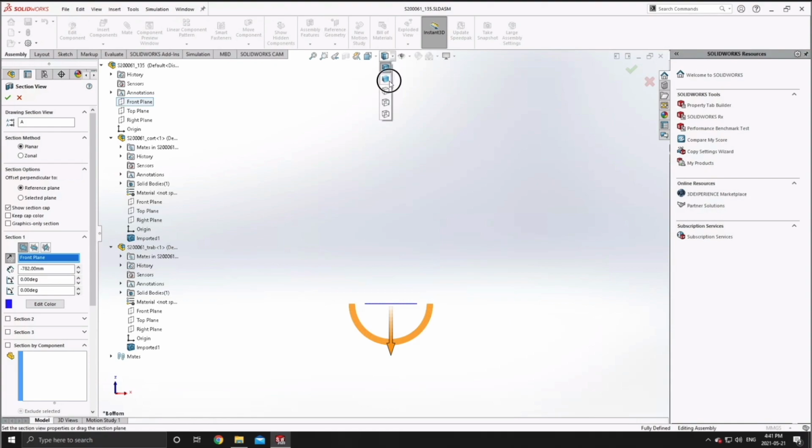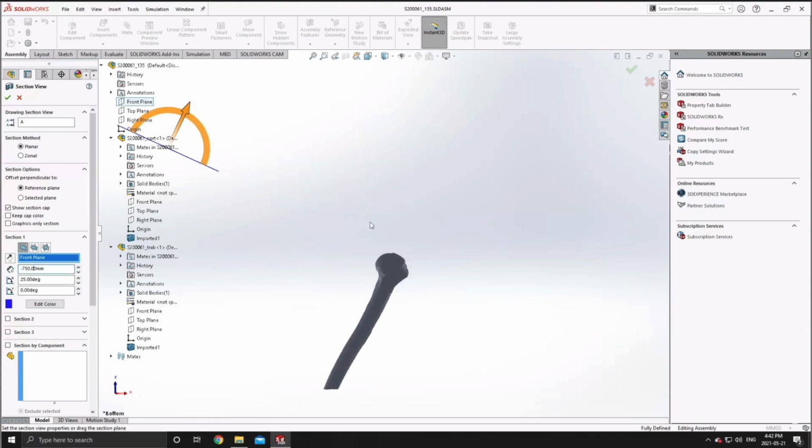So what I'm doing here is I'm essentially developing a cut plane, or in SolidWorks, a section plane, by which I can calculate, using the SolidWorks Analyze tools, the centroid of the medullary canal at distances 50 millimeters and 100 millimeters distal on the humerus from the peak of the humeral head, in order to determine what the central axis of the humeral canal is.